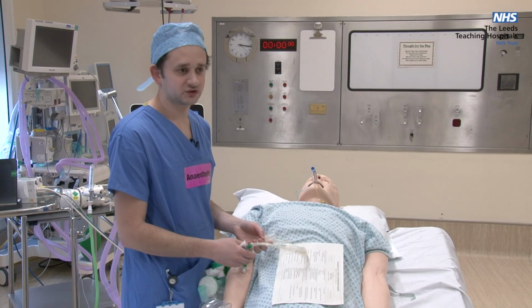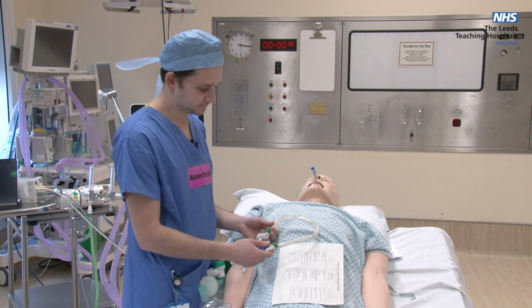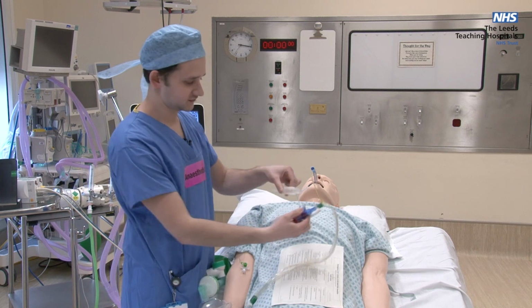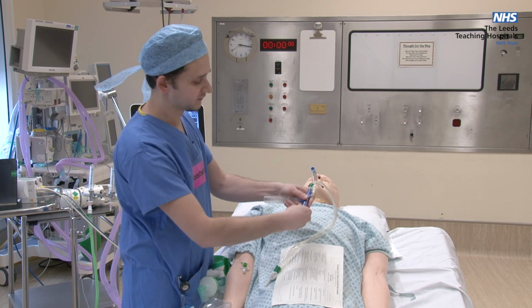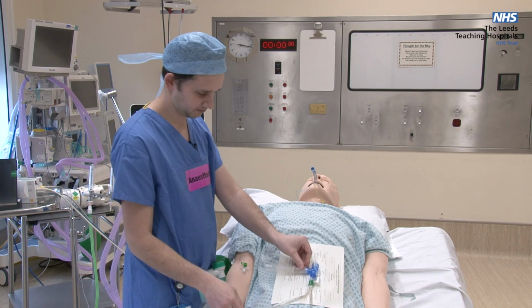Whilst the patient is being pre-oxygenated, it's the job of the assistant 1 to assemble the circuit to attach the patient to the ventilator and ET tube. So the closed circuit suctioning system will come in 2 pieces. The extension piece needs to be extended and attached like so, and the red prong needs to be removed. This is now ready for use once the patient is intubated.